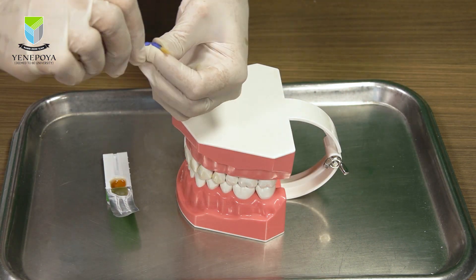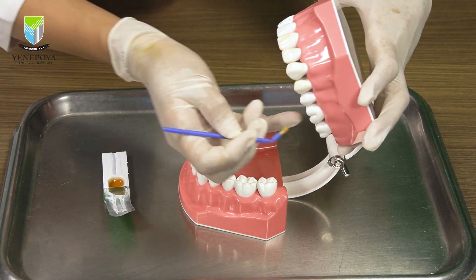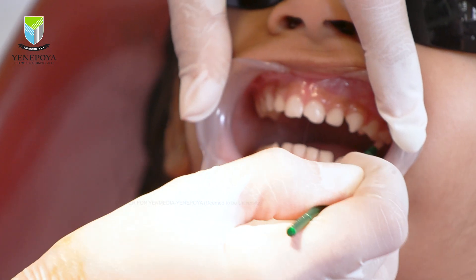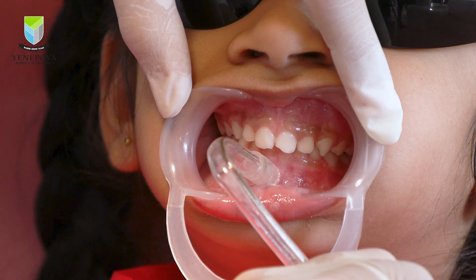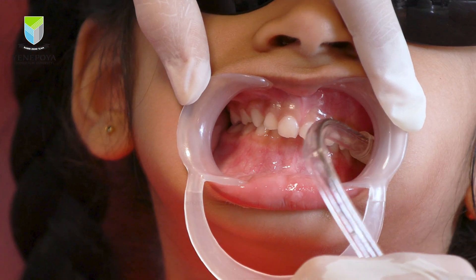You could also bend the neck of the brush to aid in easy application if posterior teeth are not accessible. Do a quick application on the patient starting from the posterior-most teeth and then moving forward. It is preferred to keep using the saliva ejector to reduce the pooling of saliva until the application is complete.